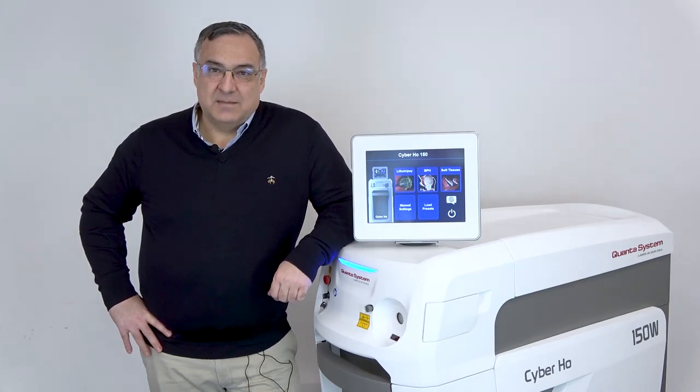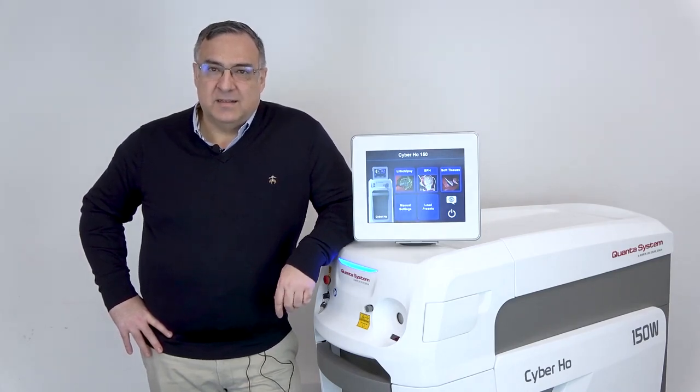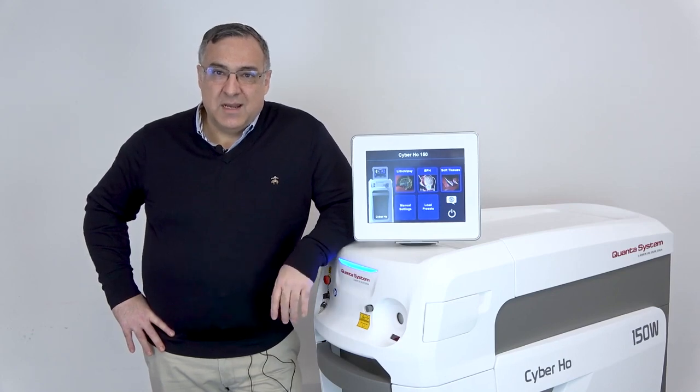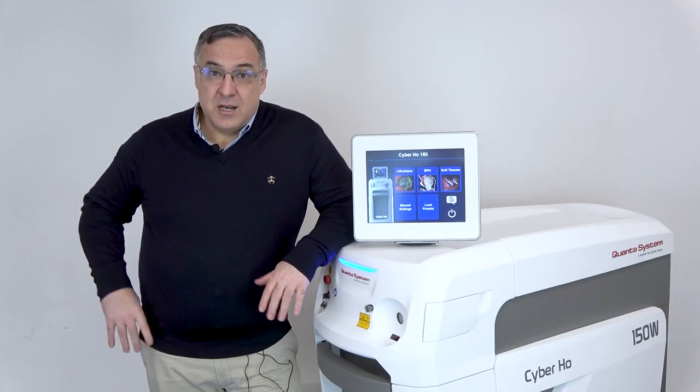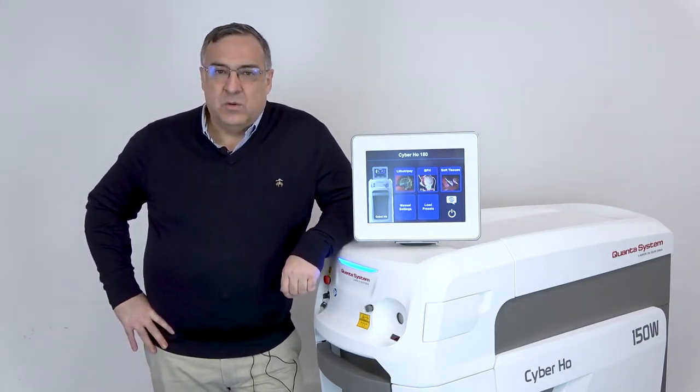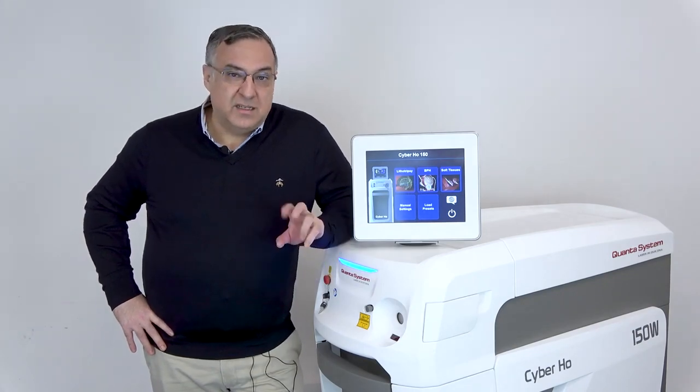Hello, I'm Fernando Gómez-Sánchez from the ICUA Clinica Central in Madrid, Spain, and I'm very excited to be in Milan at the Quanta System headquarters to learn about their lasers. I hope you will enjoy this geeky review.